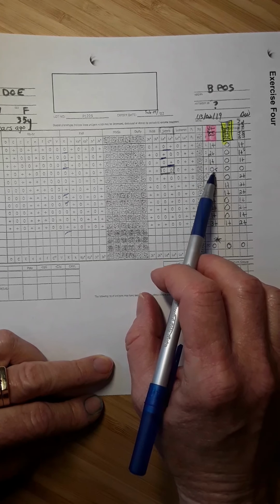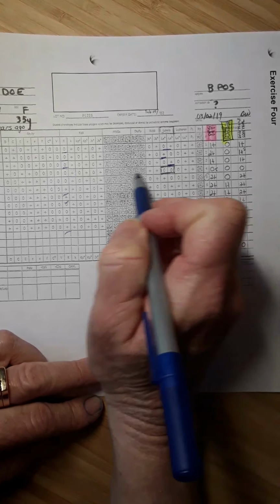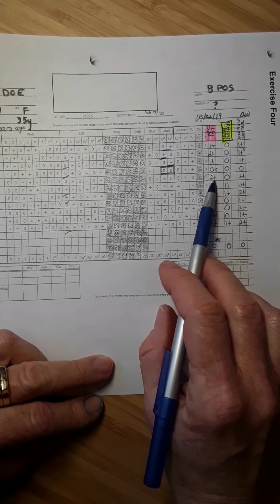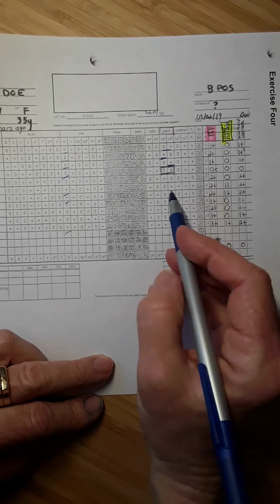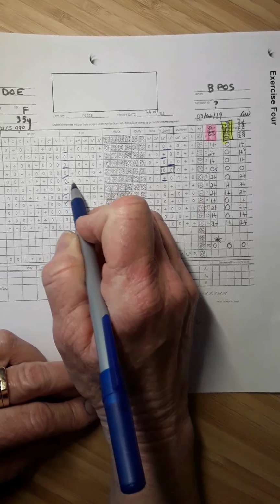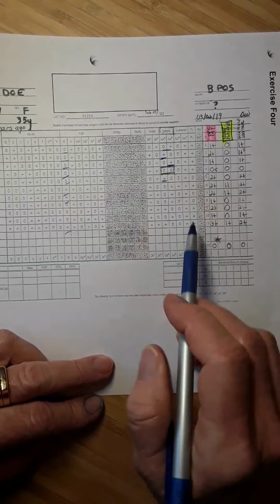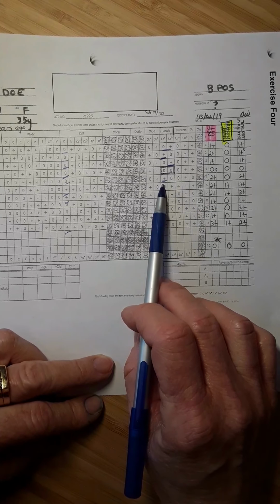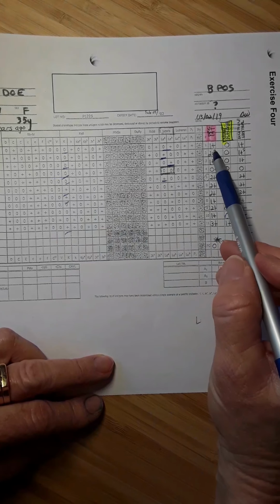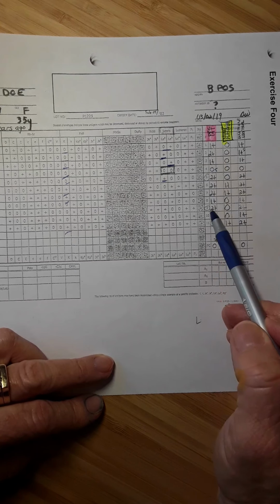Panel cell 4 did not react at all. It does not have Lewis on it. It does not have Kell on it. Panel cell 5 reacted 2+. Okay, oh, interesting. It has Lewis A on it, no K. And again, I feel like the anti-Lewis A is reacting about 2+. So I do look that over in the end to see if these strengths of reactions make sense.